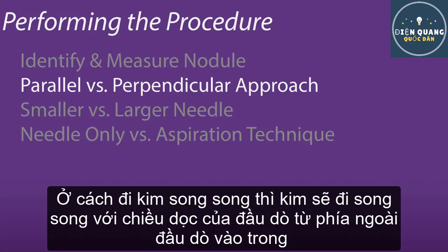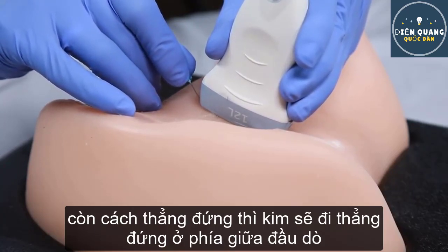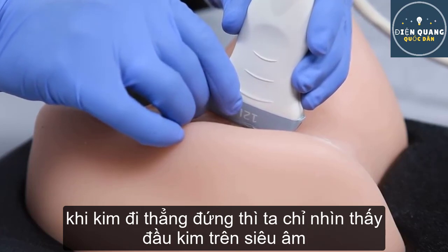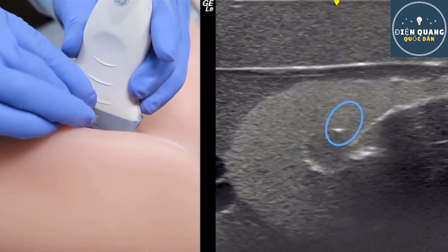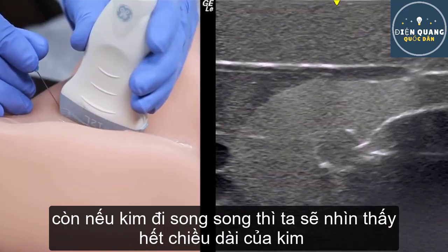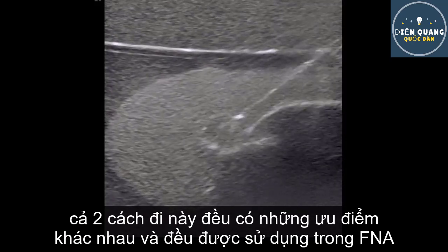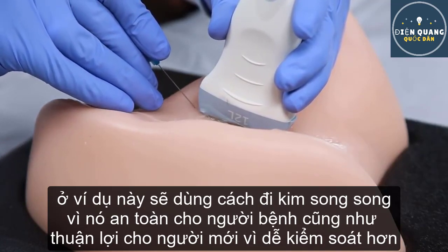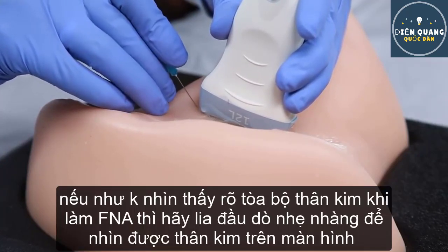There are two ways to insert the needle into the nodule: parallel and perpendicular. In the parallel approach, the needle is introduced parallel to the long axis of the ultrasound transducer. In the perpendicular approach, the needle is introduced perpendicular to the long axis of the transducer. When the needle is perpendicular, only a portion of the needle is visible, whereas when parallel, the entire needle remains visible throughout the procedure. We recommend the parallel approach since it is safer for the patient and reassures the physician that they have sampled the nodule in the area of concern.